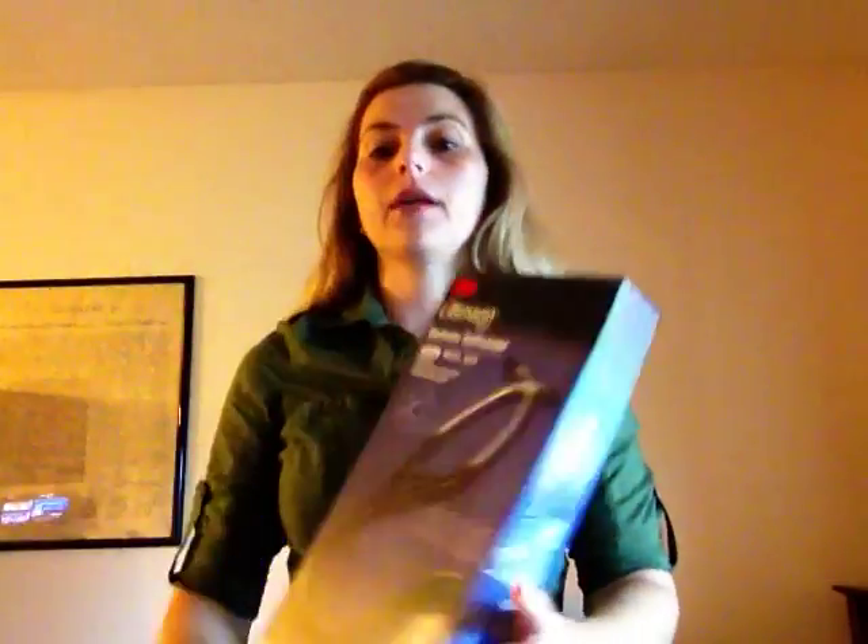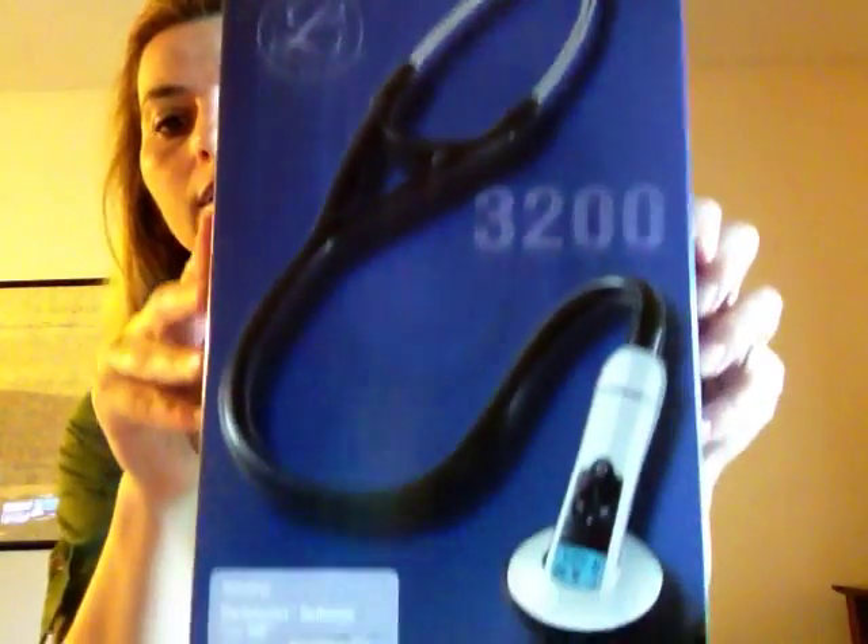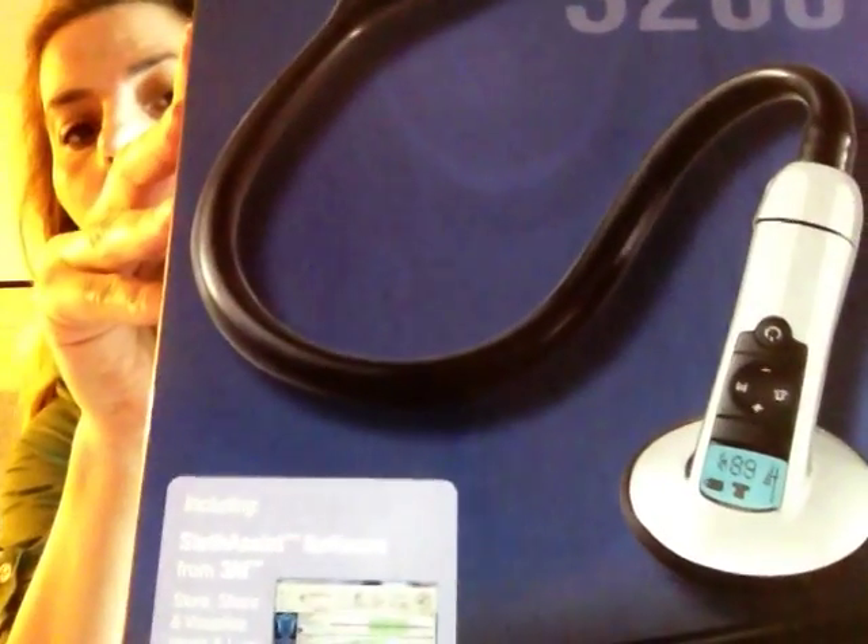The first one I have to show you is the Littmann 3200. It's very user friendly — turn it on, push the volume up and down. You can also connect this to your computer and get the data stored.